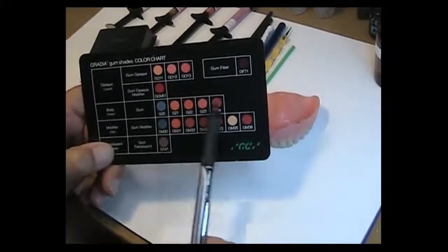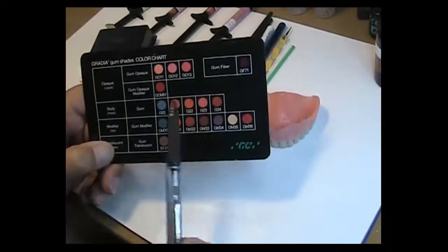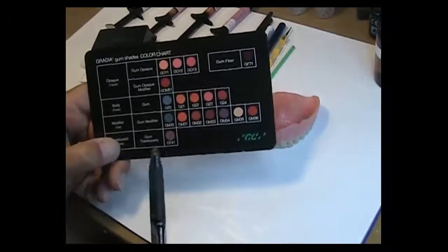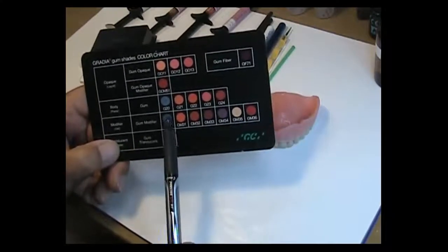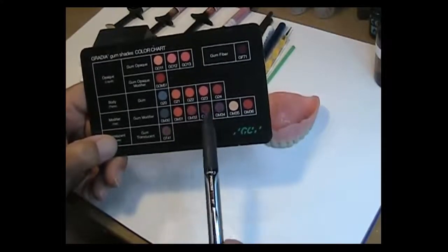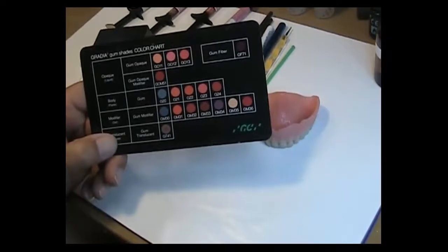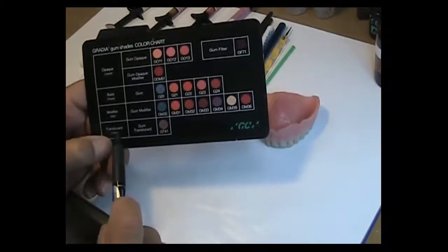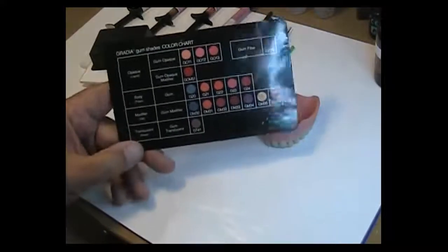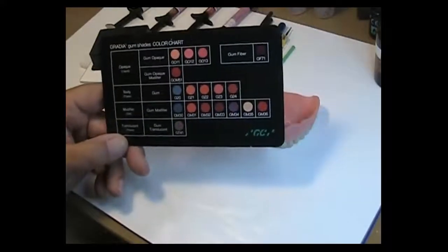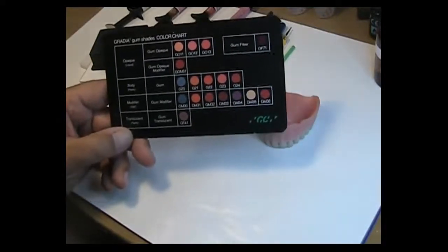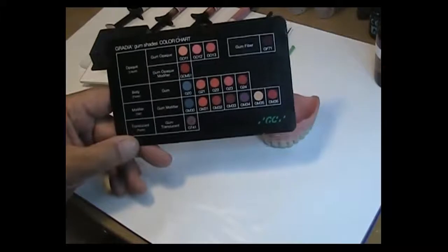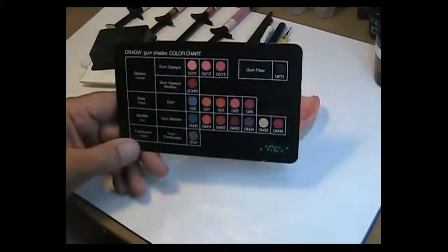My technique for colorization of denture bases has nothing to do with the bodies. In other words, G20 through G24. I don't build up with a body. What I do is I use the gum modifiers, the GM numbers. We have 31, 32, 33, 34, 35, and 36. And then of course there's a translucent paste which I call a carrier. For my recommendation, for those who just want to jump in and give it a roll without getting too confused, let me recommend just a couple of these colors.